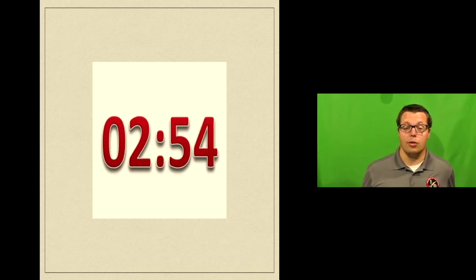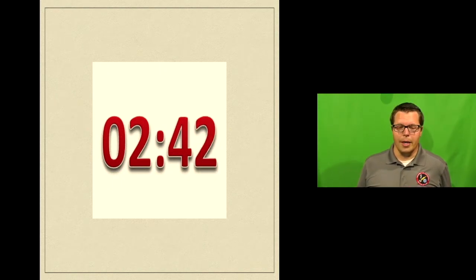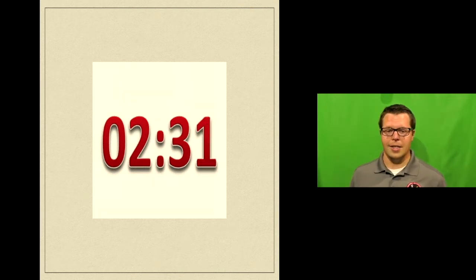Don't be in a huge hurry to make a whole lot of settings immediately after you put somebody on the vent. Let them sit. Likewise, after you make any changes, let them sit for a couple of minutes unless you've got to do something life-saving immediately, in order to prevent something terrible from happening. But give them a minute, or give them 3 minutes to actually equilibrate out and see how these vent settings are tolerated, and see how the vent's breathing with them, and then you can use that time as a little bit of meditative time to cogitate on what is going on with the patient and what sort of settings we might make otherwise.